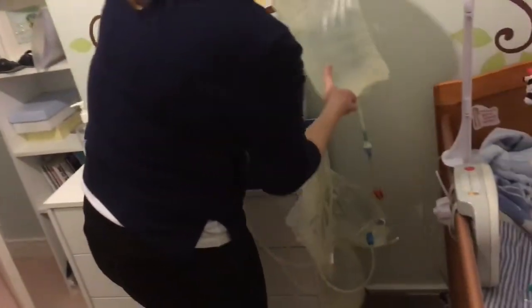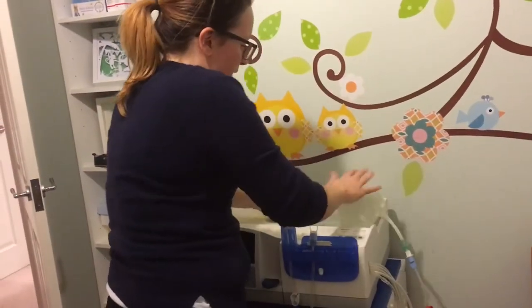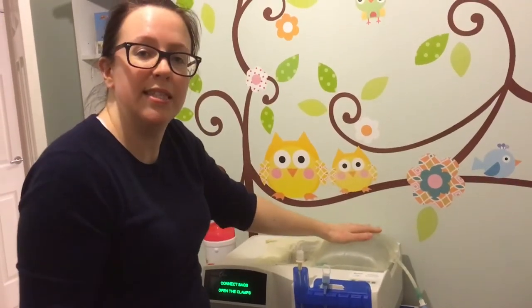So I'm going to pick the red bag up now it's drained, and it can sit on the top on the heater. That plate will warm it up so that it's nice and warm when it goes into Ethan's tummy.